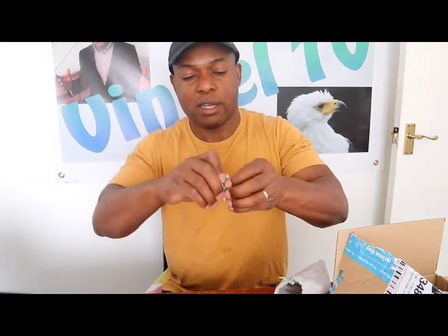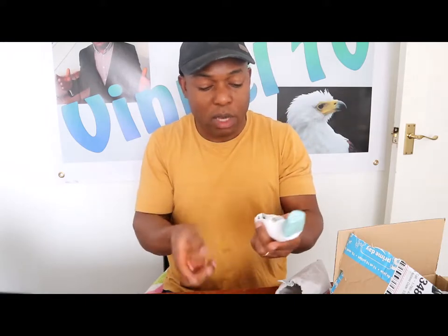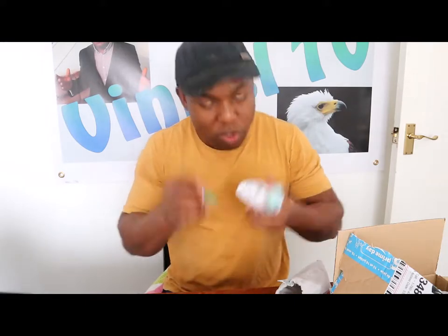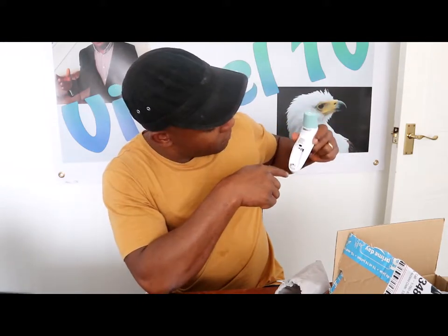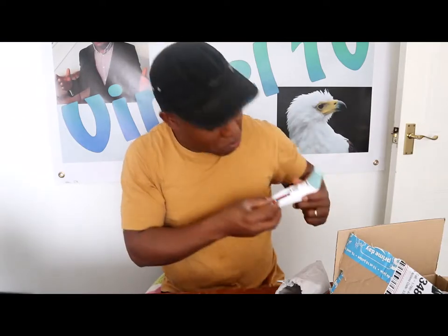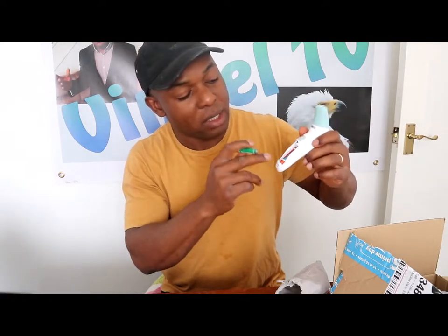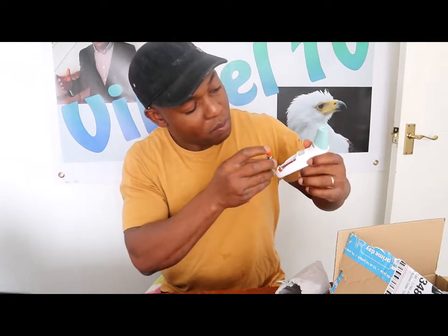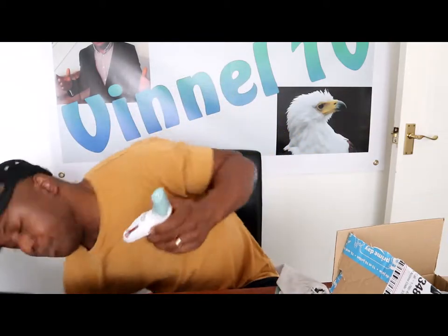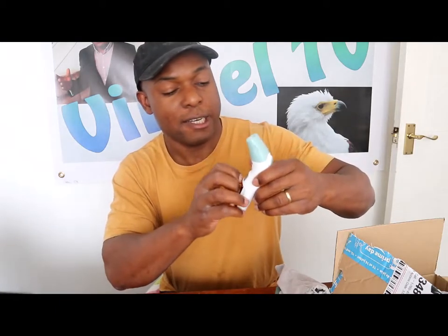This thermometer is very good — especially for families with children. Align the negative to negative and positive to positive. Negative first at the bottom — actually it's the other way around. Align negative at the bottom, positive at the top.